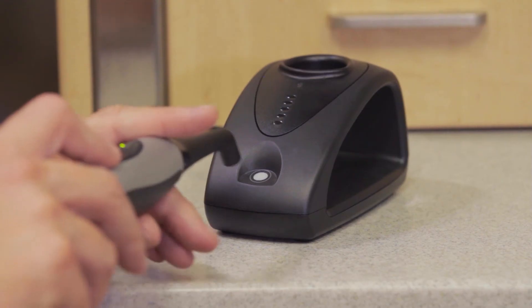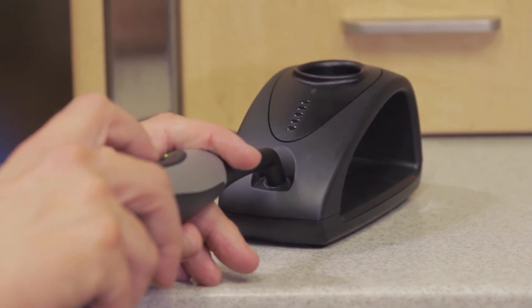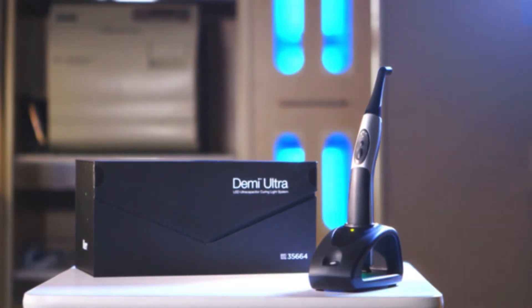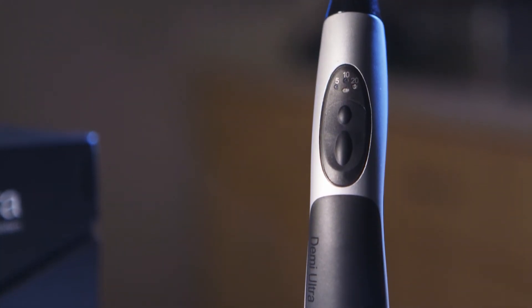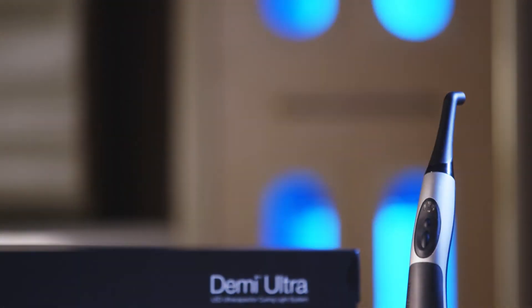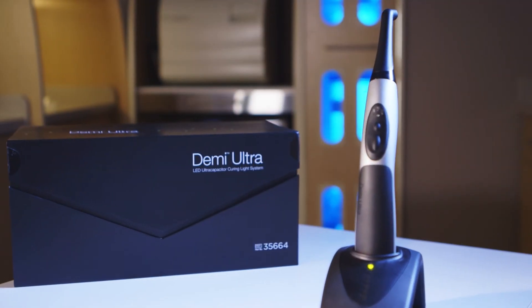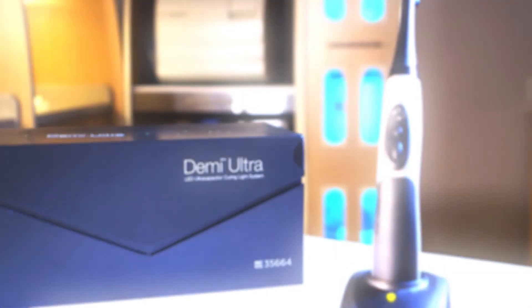The charging station itself has a built-in radiometer that allows you to check and make sure that you have adequate output from the device. I really think that if you're in the market right now for a new LED curing light, or think you're going to be in the future, you definitely owe it to yourself to add this to the short list of devices you want to take a look at and potentially bring into your practice. I've had a really good experience with it, and I think this is something you really ought to consider to make your life easier and the lives of your patients easier too.